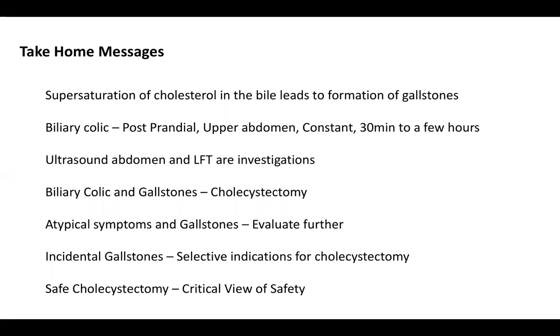Nishant is asking, how do we identify the junction of cystic duct and CBD? Because when we use excessive traction, we might be pulling on the CBD also and inadvertently clip a circumference of the CBD. Very good. I think that's a very practical question. So two points that I'd like to make. One, going by the current evidence, it is not necessary to dissect the cystic duct till its insertion into the common bile duct. You can just milk the cystic duct, and if you're sure that there is no cystic duct stone, you can clip it even leaving behind a small stump.